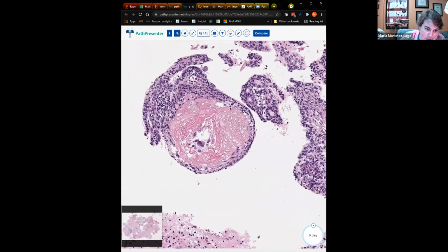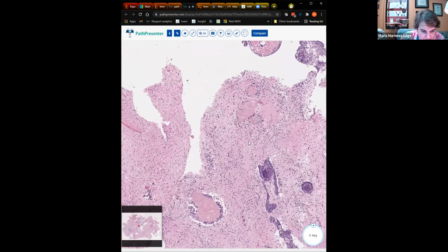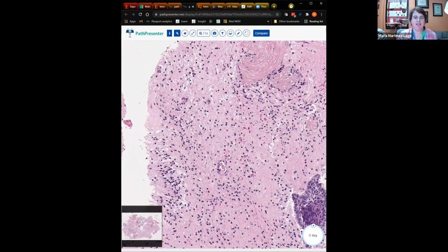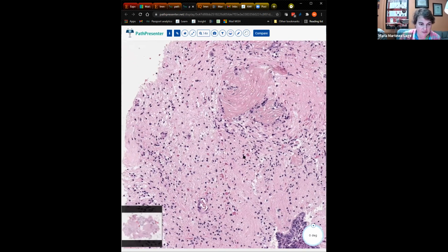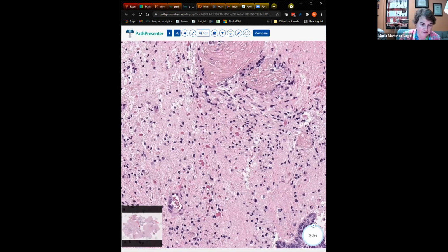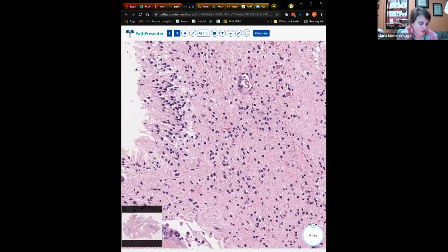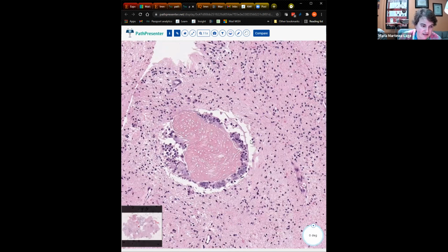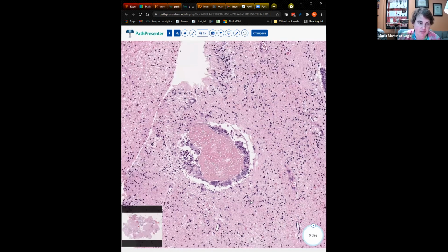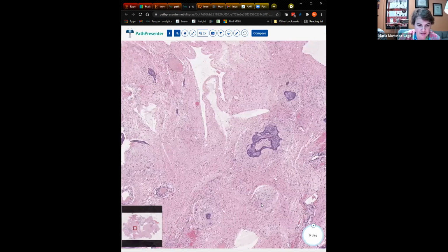Let me show you. Here's an example of an area of wet keratin that's starting to calcify in the center. I was mentioning the other day how these tumors can create a response in the surrounding neuropil that is not infrequently characterized by the presence of Rosenthal fibers, which is what you're seeing here, all these thick eosinophilic structures in the background of increased cellularity. So it's an area of piloid gliosis with Rosenthal fibers that is, again, associated with the presence of these epithelium with wet keratin.